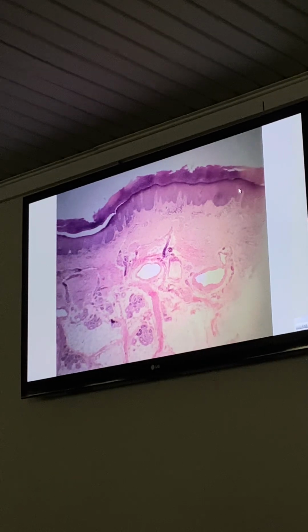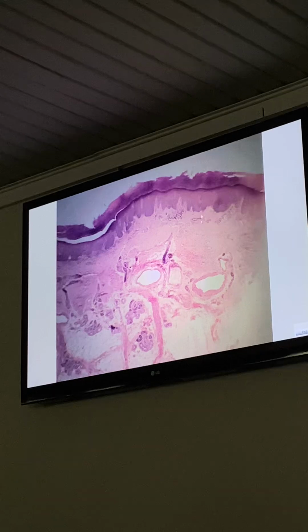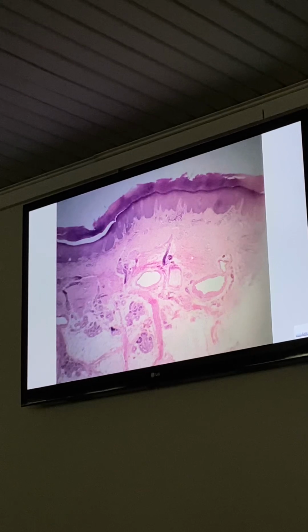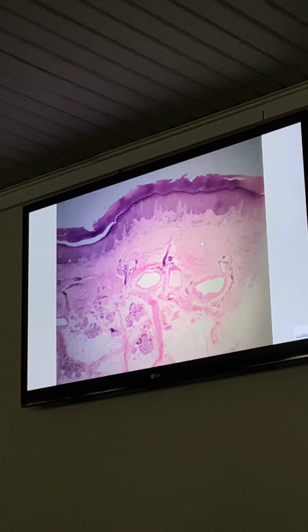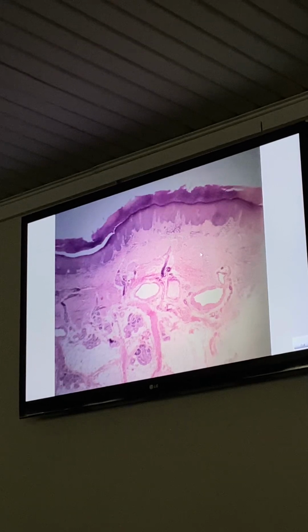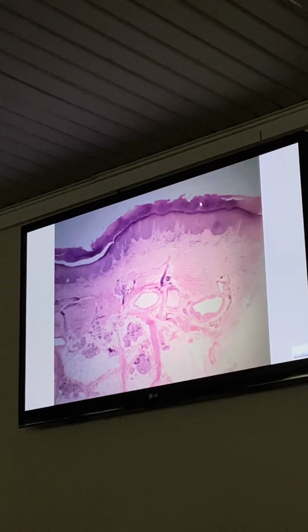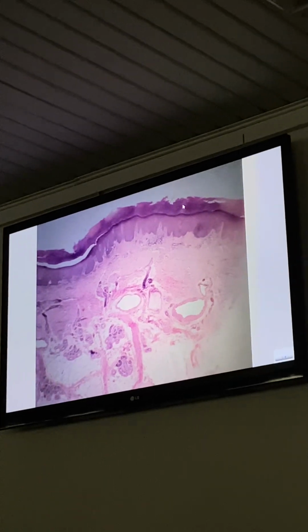You can see there are two layers, epidermis and dermis. The epidermis originated from the ectoderm, while the dermis originated from the mesoderm. In thick skin, you can see exactly in the epidermis layer, we can see 5 layers.